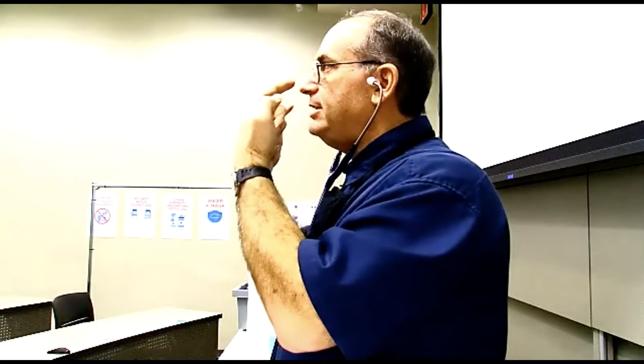Your ear canals are not straight where you'd be able to see right through your head. They go forward towards your nose. You want the sound to go towards your eardrums from the stethoscope. You don't want to send the sound backwards towards the back of the ear. You want it to go forward. So this is the number one thing.